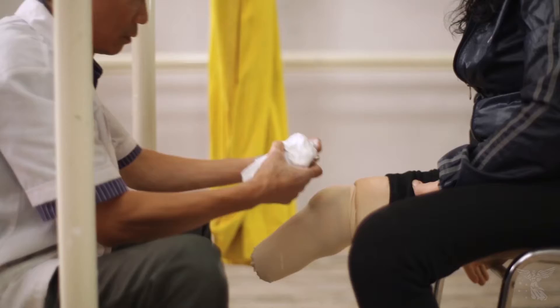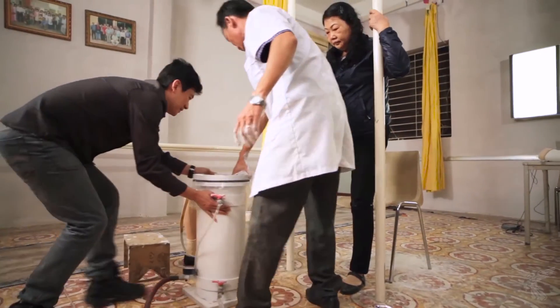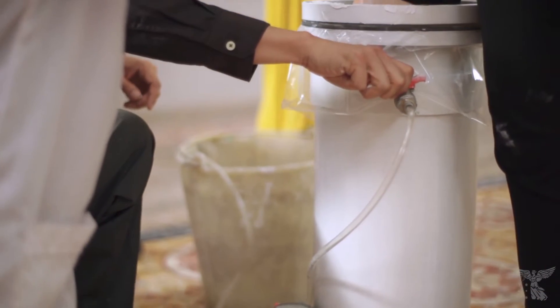When the patient presents, we wrap their residual limb in a plaster wrap, which they then place into the PCAST tank. We turn the taps and water rushes in, and this water pressure actually moulds the plaster cast to the exact anatomy of the participant's residual limb, so there's no modifications or adjustments required by the prosthetist.